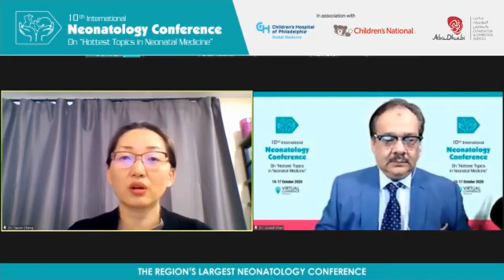There is old literature from Japan, decades ago, that shows that an EEG at discharge can help predict who is likely to go on and develop infantile spasms from the EEG background. For us, based upon our experience of knowing the clinical history, the EEG and the MRI, there are some patients we will automatically do a 2-3-month EEG, where we're looking for very early features of them developing hypsarrhythmia and infantile spasms, or actually developing seizures.